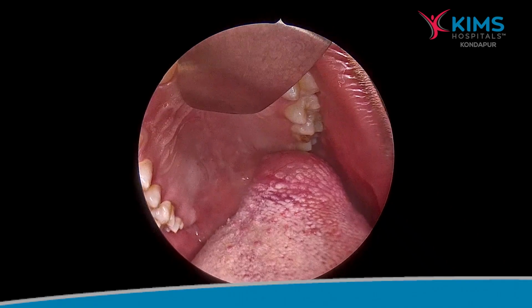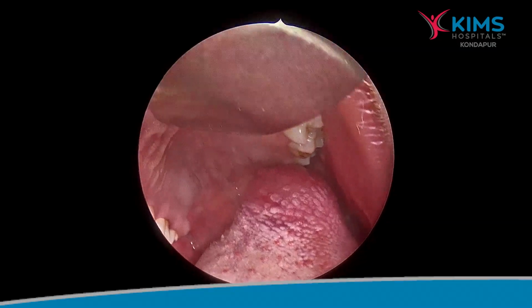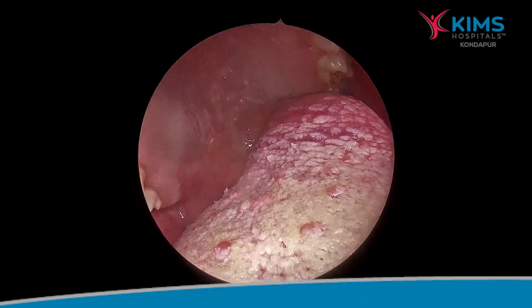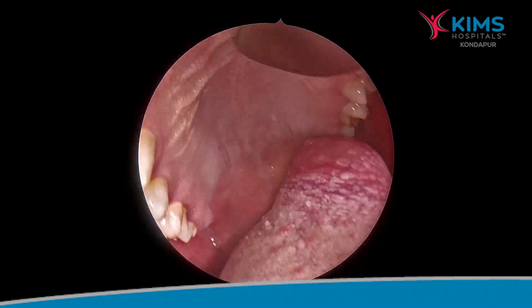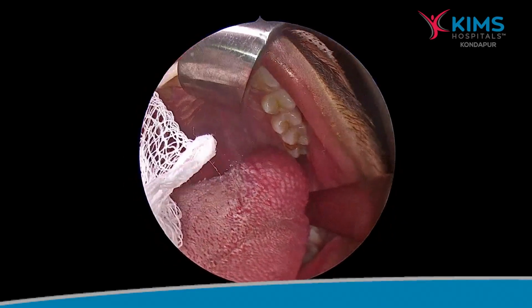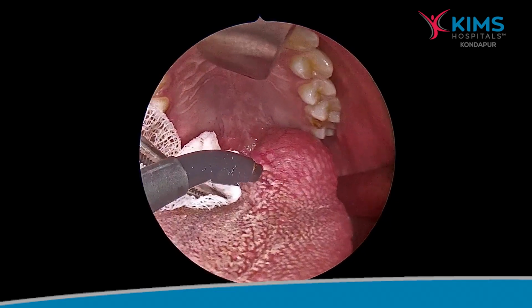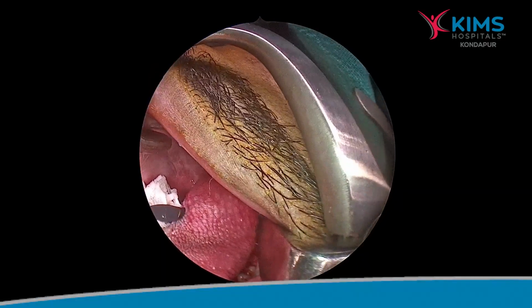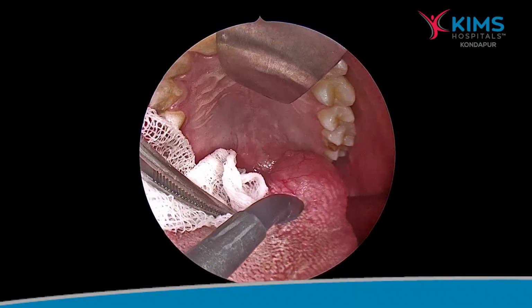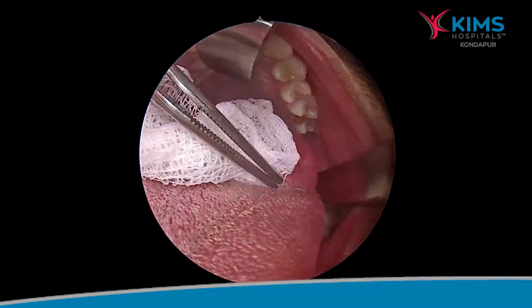I am also presenting a video of the excision of the tumor and the surgical procedure. This is the endoscopic view of the base of the tongue tumor. You can see it has a rounded appearance on the left side. The mouth opening is done using a Doyne's mouth gag. At the angle of the mouth on the left side, we used a right angle retractor.